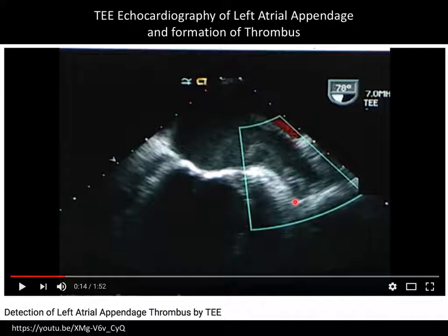You've got to get this call right. You can't miss this one. And just say, oh, looks pretty good. I think there's no signal there. There's a little funny noisy thing, but I don't think it's a thrombus. Well, you want to be damn sure it's not a thrombus, right? So this is where image quality and everything comes in, because it really counts to make that call right.